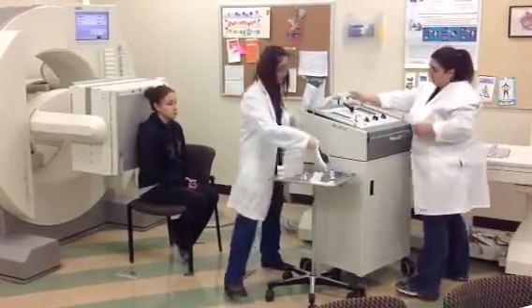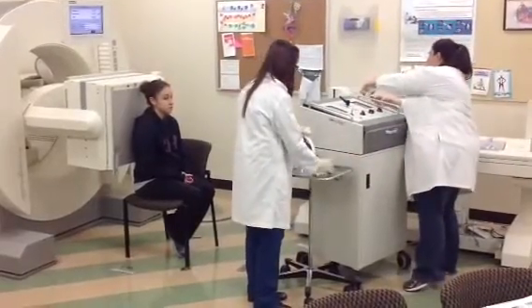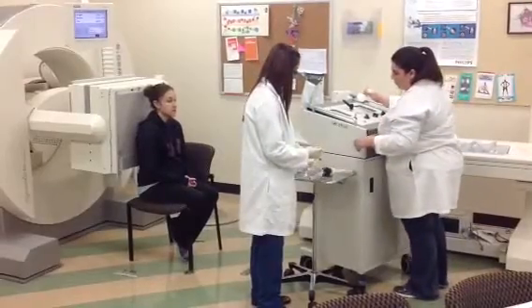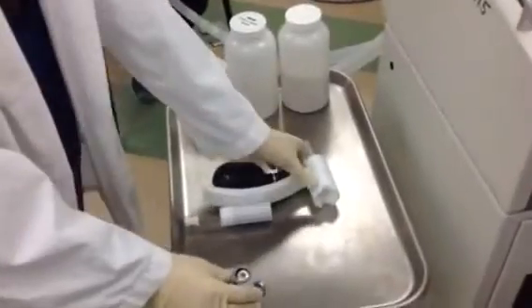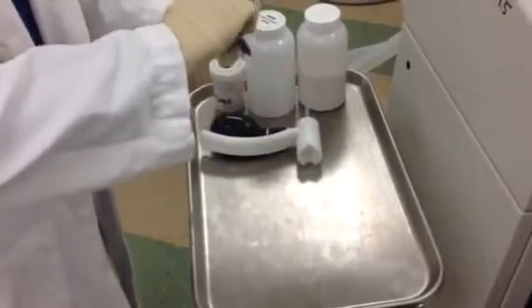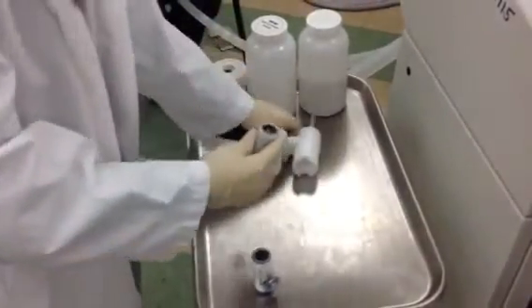Advise the patient to breathe normally. Observe breathing bags moving through the front panel windows. Add oxygen if necessary for patient comfort. Once the patient reaches equilibrium, 1 to 2 minutes, the counting rate on the camera stabilizes. Switch to washout, position number 3. Turn the trap airflow control to 50, about 10 seconds before going to washout. Take washout data on the camera.